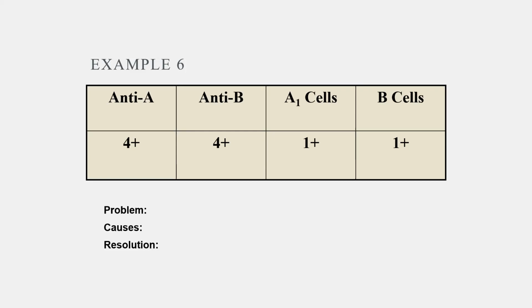what you can do is take a donor unit that is labeled A1 and a donor unit that is labeled B, and phenotype those donors for M. If you have done an antibody workup and determined it is an anti-M causing this discrepancy, phenotype some donors, find a B donor that's M negative and an A donor that's M negative. And you're basically treating those donors' cells as your reagent cells. So you can prove that this AB patient does not have A1 antibody or B antibody. Does that make sense? That was a lot.